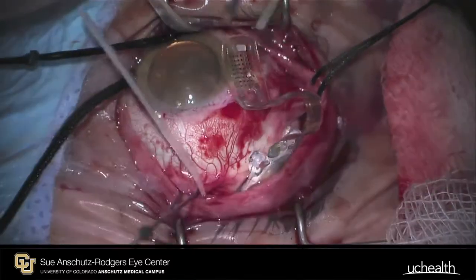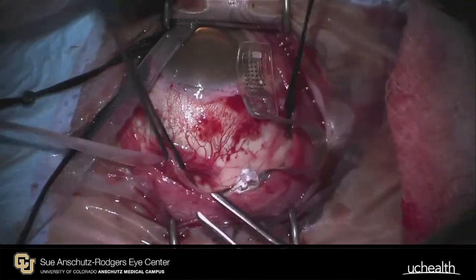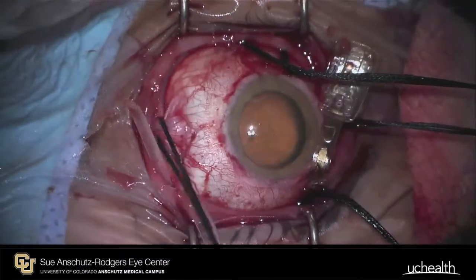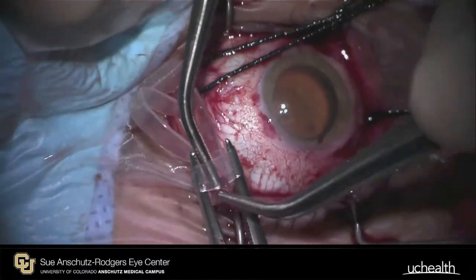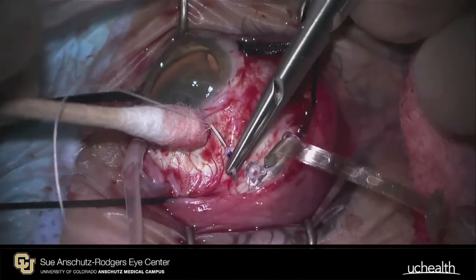Shown here is the processing unit and antenna, which are placed on an encircling band around the globe. The band is passed under the extraocular muscles in a fashion identical to placing a scleral buckle. An Awatski sleeve is placed supranasally.